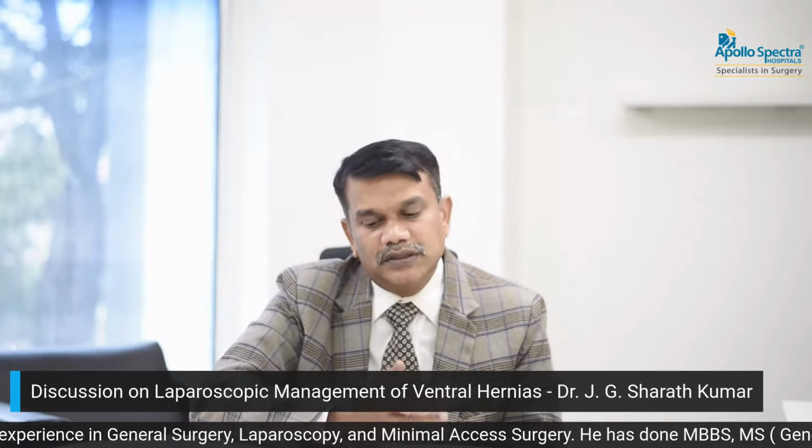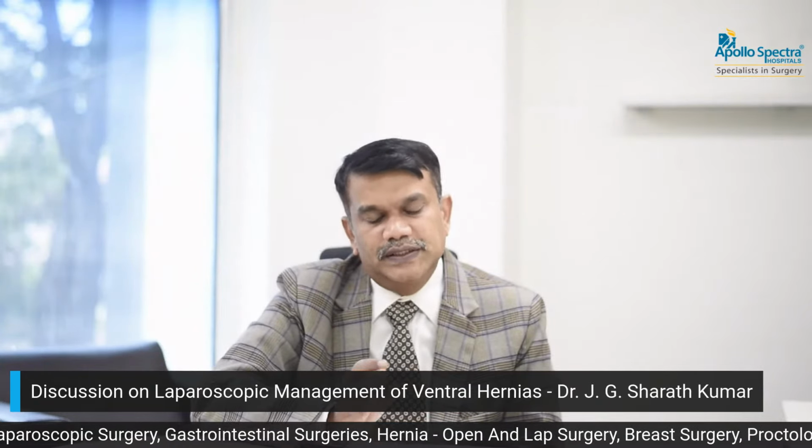Other complications are postoperative pain due to transfascial sutures and tacker application. It may cause little pain for a few days. Then postoperative ileus due to handling of the bowel. Sometimes there will be trocar site infections and fistula formation. Sometimes bowel obstruction, rare causes of recurrence and fistula formation, and some more rare causes like pulmonary embolism. So this is a brief about laparoscopic management of ventral hernia.